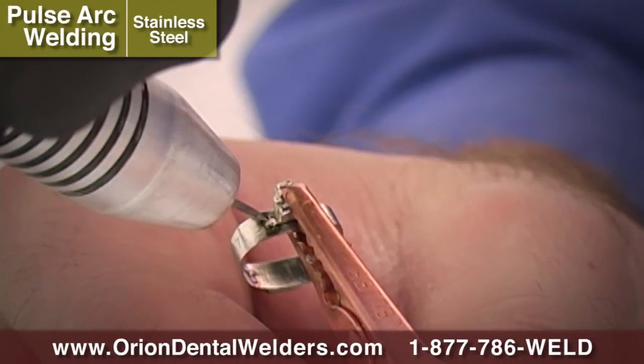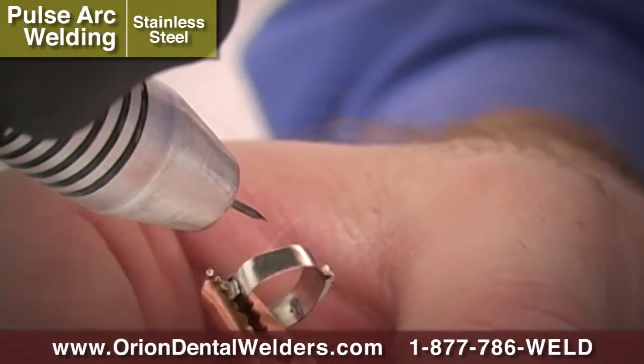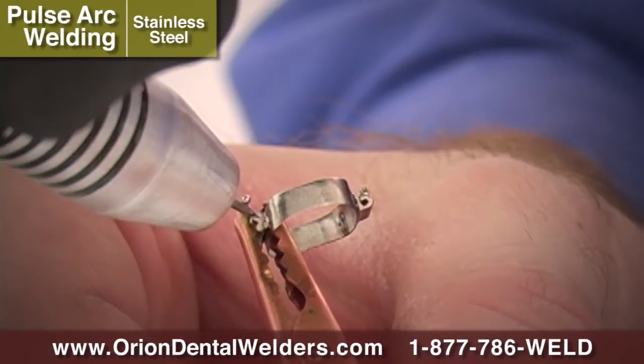After temporary placement, use the Orion's Micro Pulse Arc Mode to create a permanent joint between the buccal tube and the molar band.